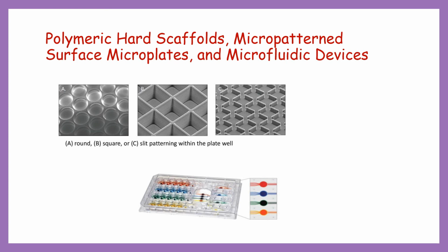Polymeric prefabricated scaffolds such as porous discs, electrospun scaffolds or orthogonally layered polymers are physical supports that can be an inert matrix or designed to mimic in vivo ECM on which cells can attach, migrate or fill scaffold compartments to form 3D cultures carrying a geometric configuration.